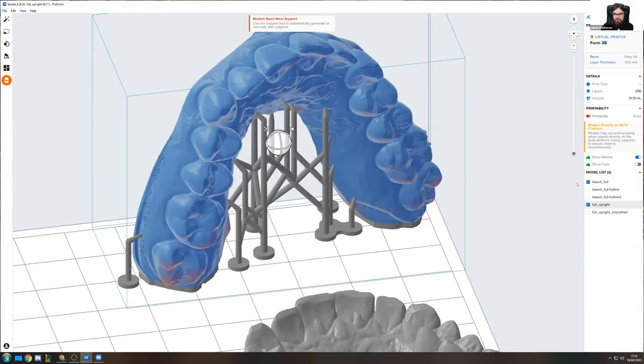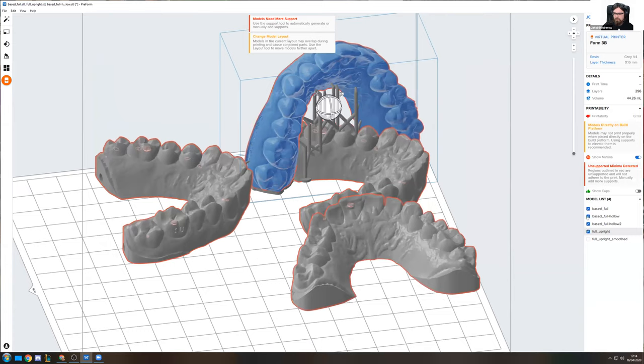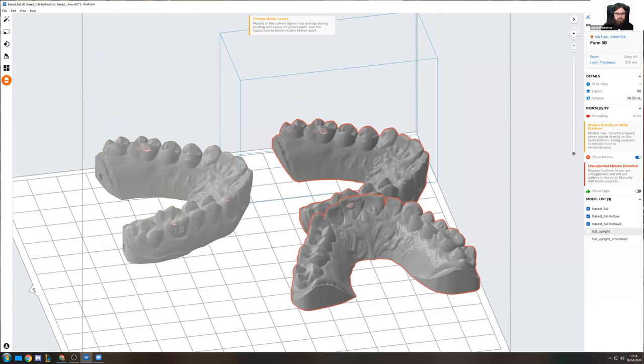But what we can also do is hollow our model. So I have two variations of that right here. Let me just take out this one right now.